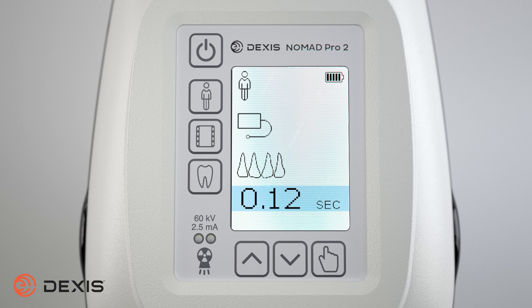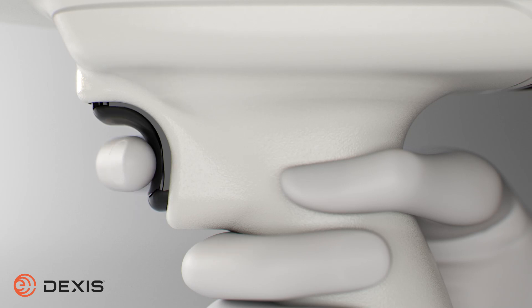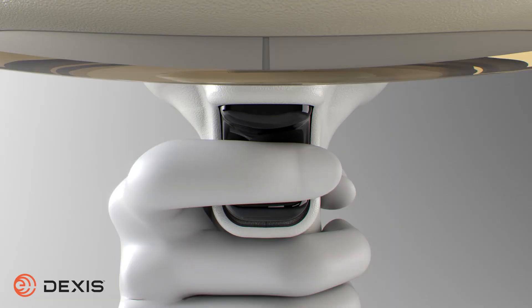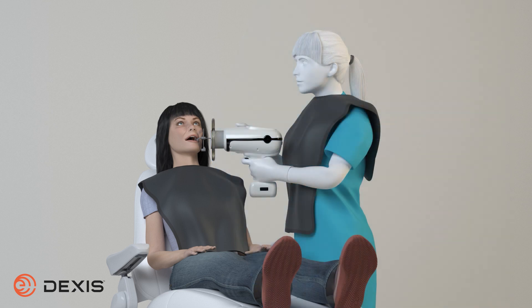As a safety feature, you must first enable the device prior to exposure. To do this, you must pull the trigger once. Once the Nomad displays a ready message, hold the exposure button down until the process completes to acquire an image. Do not enable the Nomad until the patient and operator are positioned properly and ready for the exposure. This includes covering the patient with a lead apron or taking other safety precautions according to your location's regulations and requirements.